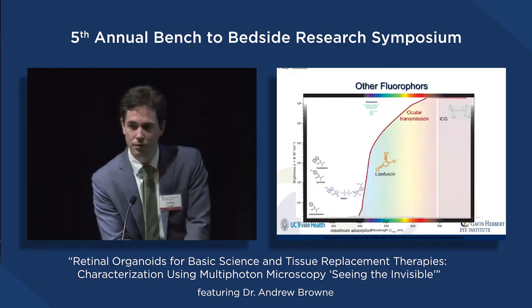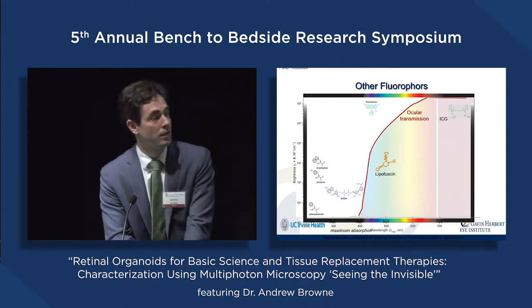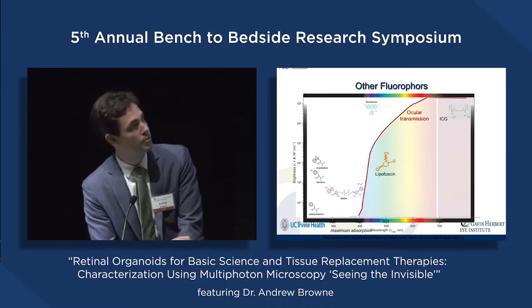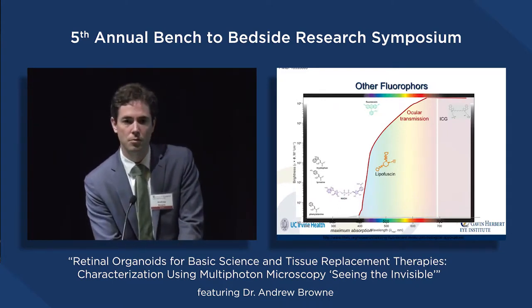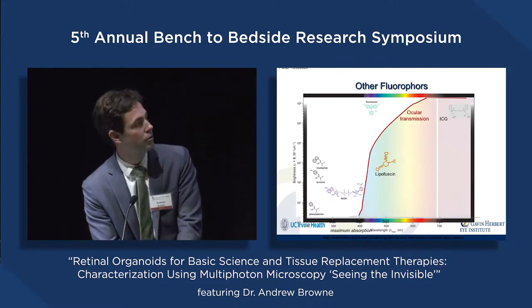In ophthalmology, there are very few of these that we use in clinical practice that are particularly interesting to us. We have fluorescein. We've heard about that today in at least one talk. We've heard about ICG. Regardless, we use them both a lot in ophthalmology to look at the quality of blood flow in the retina, to see how well the blood vessels are working and allowing these dyes to flow through them when we take these photographs.